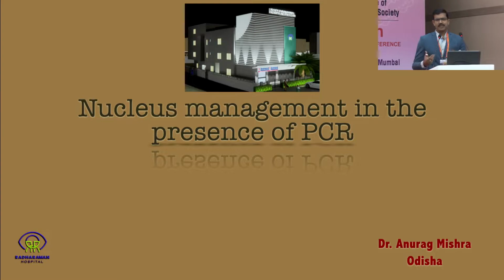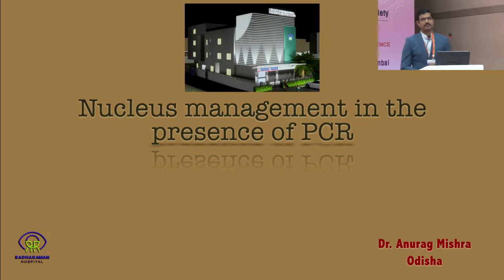I'm not going to speak anything new because this is something that we have actually learned. This is a stepping stone of learning cataract surgery: the event of posterior capsular rupture and the further nucleus management, or whatever is left in the bag or in the eye, the removal of the same to ensure that everything is clean before you implant an intraocular lens. So what I'm going to do is give a concise, refurbished presentation of what we have already learned. I'm going to share with all of you 3 twos in the next 6. That's the correct way to put it.